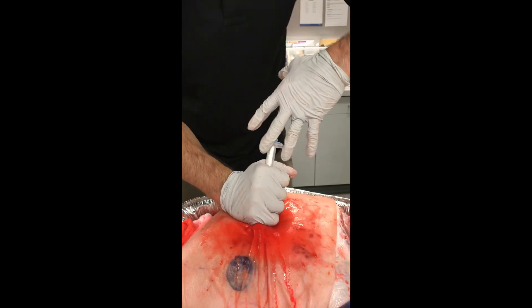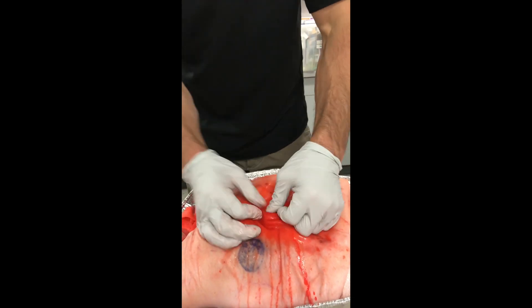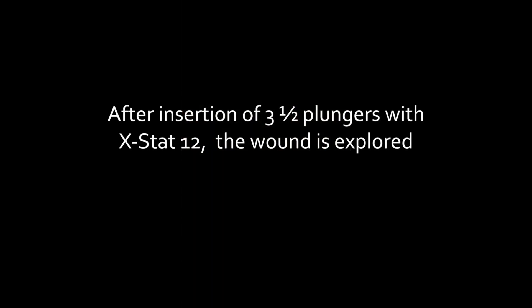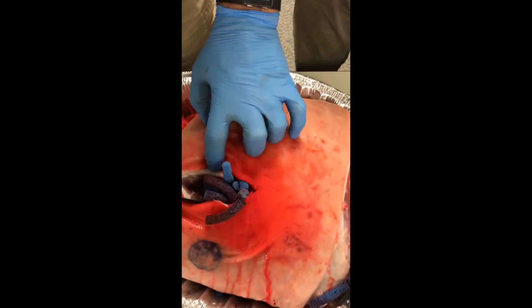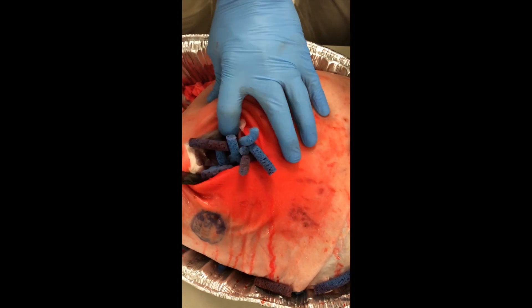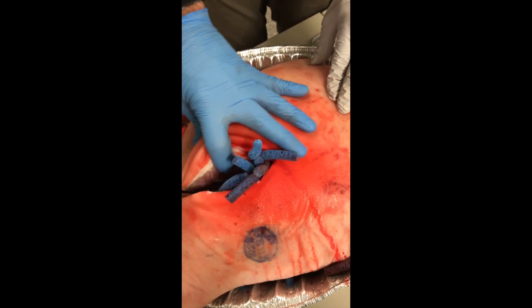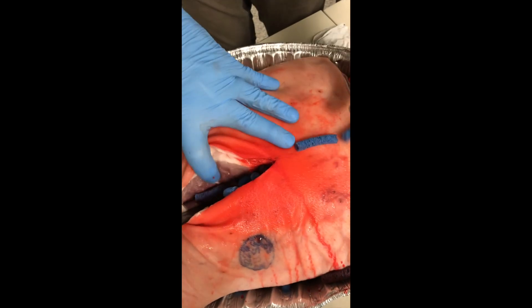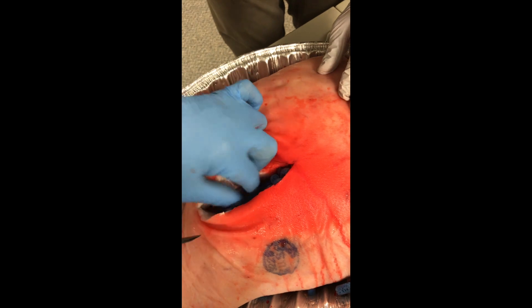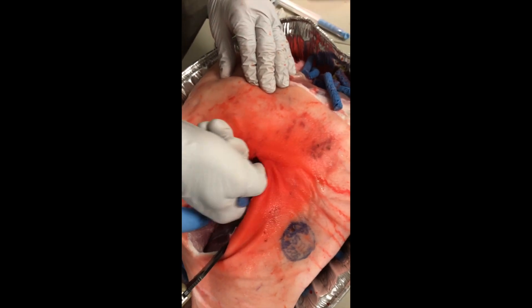That's a good one. Just keep coming out of there, all the way back here where the wound track was — look at that, all the way back here. Take this out of there by hand for a second. There's the bulk of it right there. Look at that.